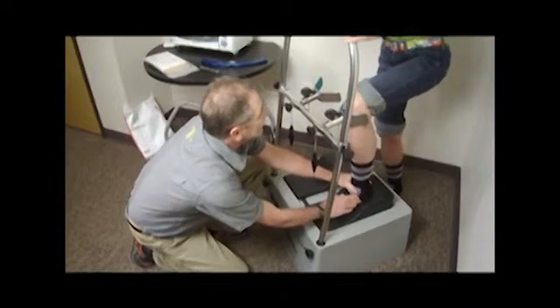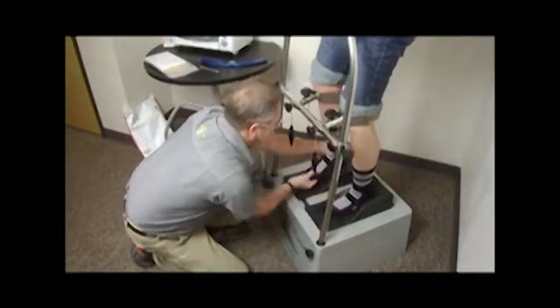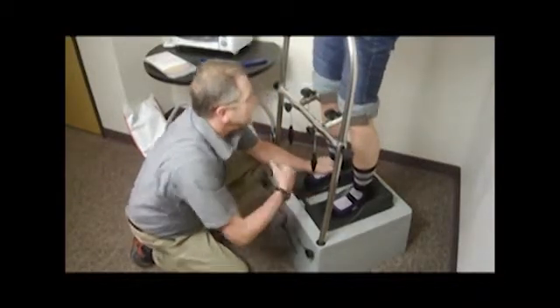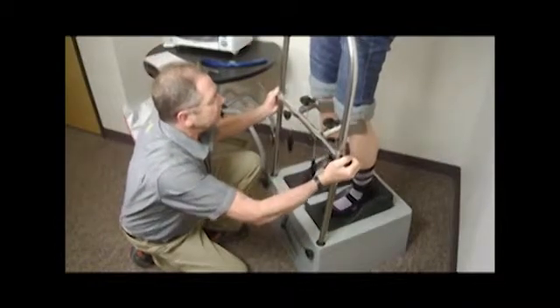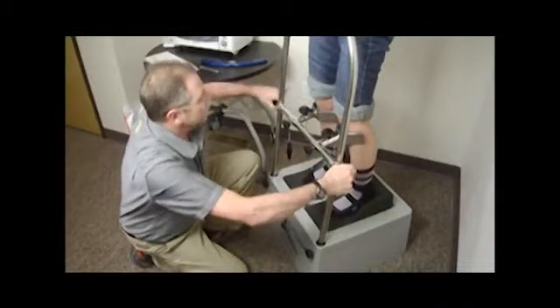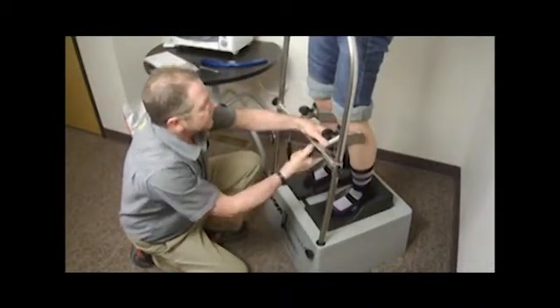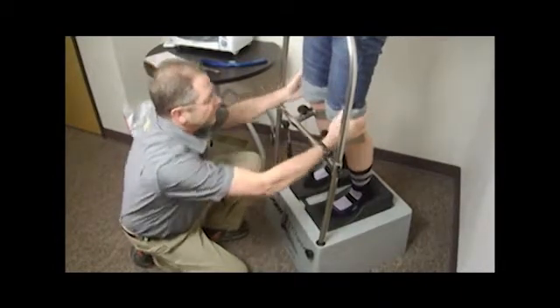Okay, big step up now. Now the right foot. Again, take control of the patient, locating the foot where you want it. Go ahead and step down. Now we're going to position the knee cups so that they're slightly below the patella at the tibial tuberosity. So slightly below, a slightly upward angle of the knee cup. Go ahead and bring those knees forward for me.